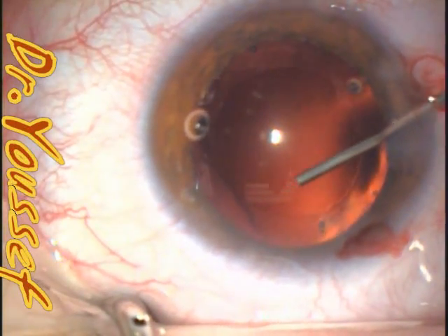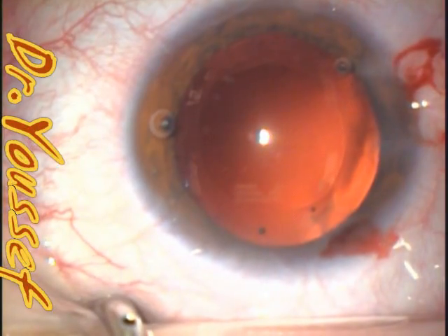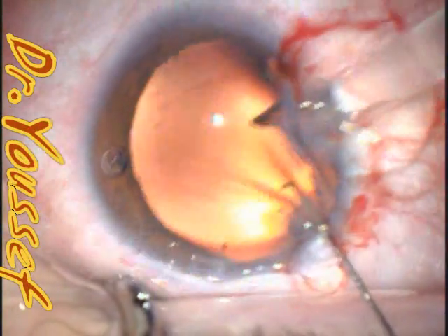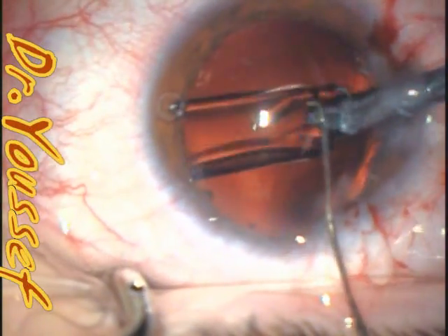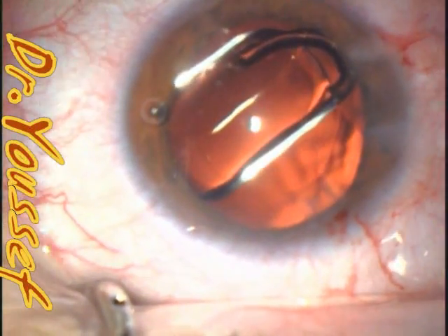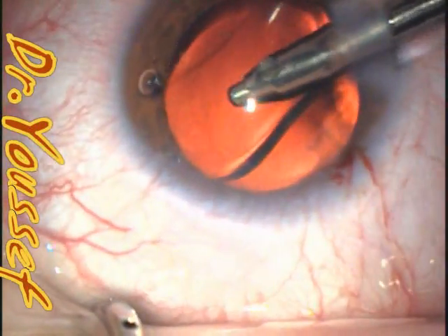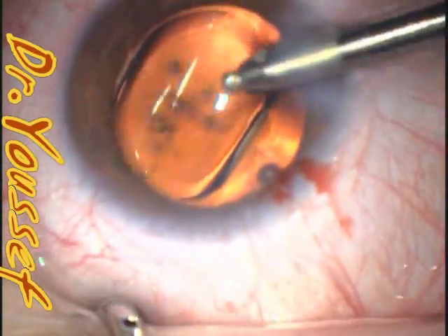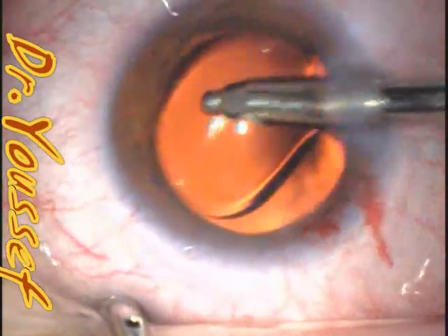This is the ProVisc being injected into the capsular bag. The intraocular lens is a Z-CB00, a thick one-piece lens. It looks okay, but if you notice, the trailing haptic is opening — it disappears under the iris, supposedly into the capsular bag, but in this case it wasn't.